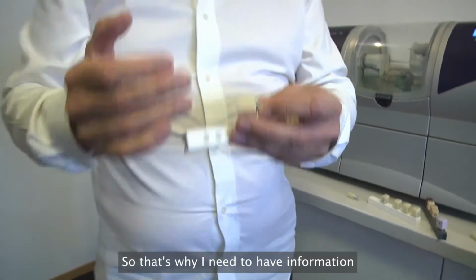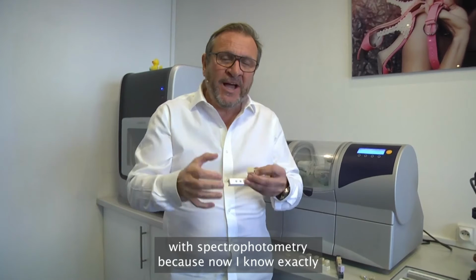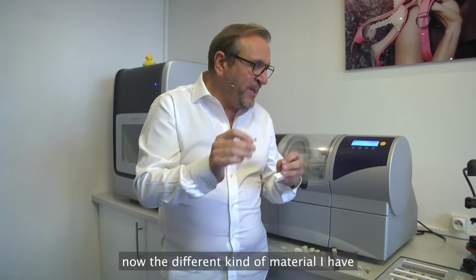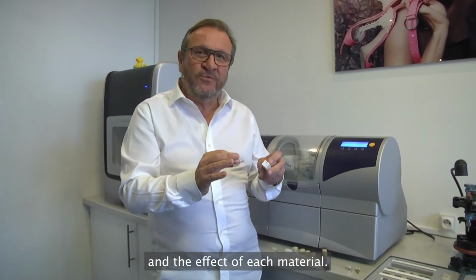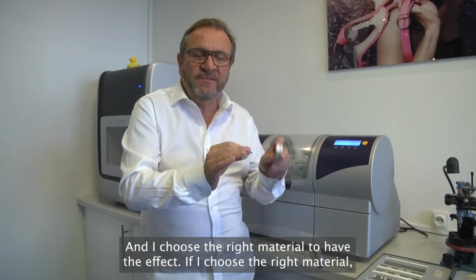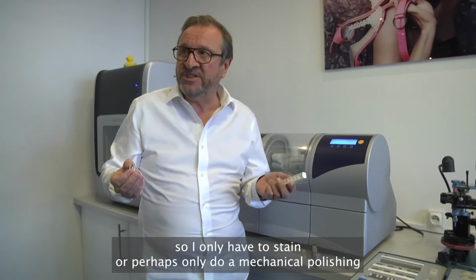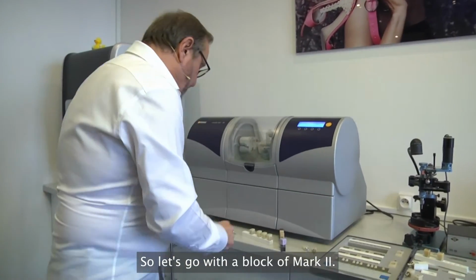So that's why I need to have information from the spectrophotometer, because now I know exactly the size of my enamel, the size of my dentin, and I know now the different kinds of material I have and the effect of each material. And I choose the right material to have the effect. If I choose the right material, I only have to stain, or perhaps only mechanical polishing, and have a good result. So let's go with a block of Mark II.